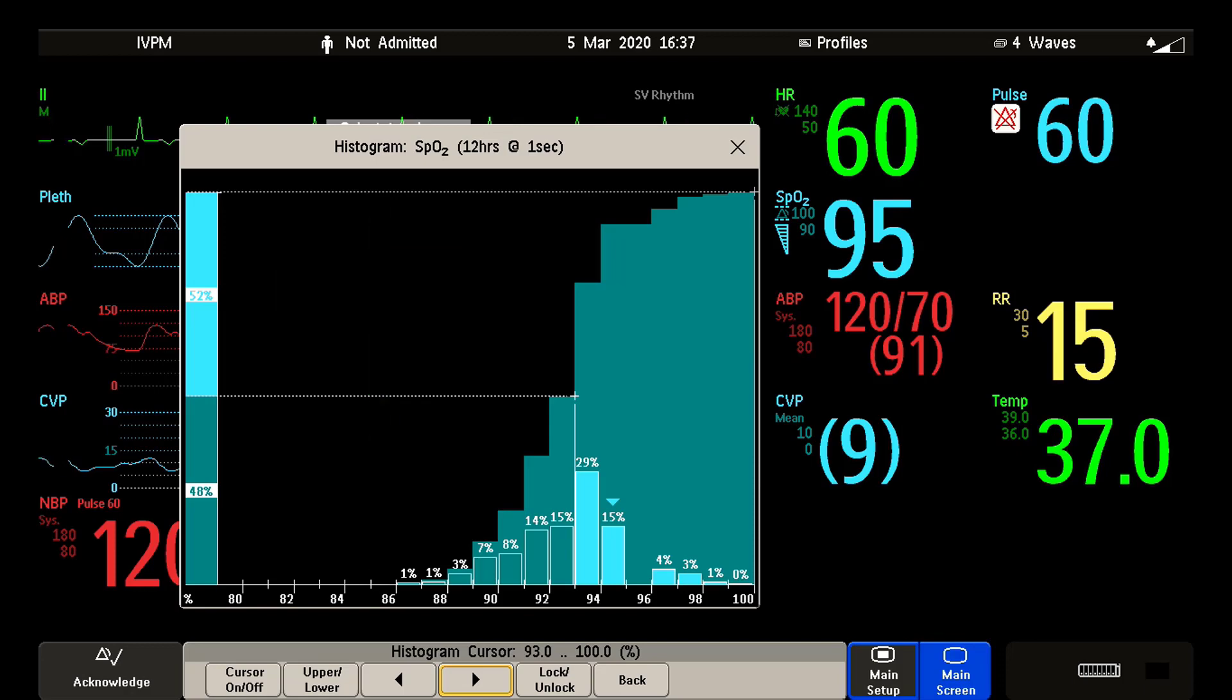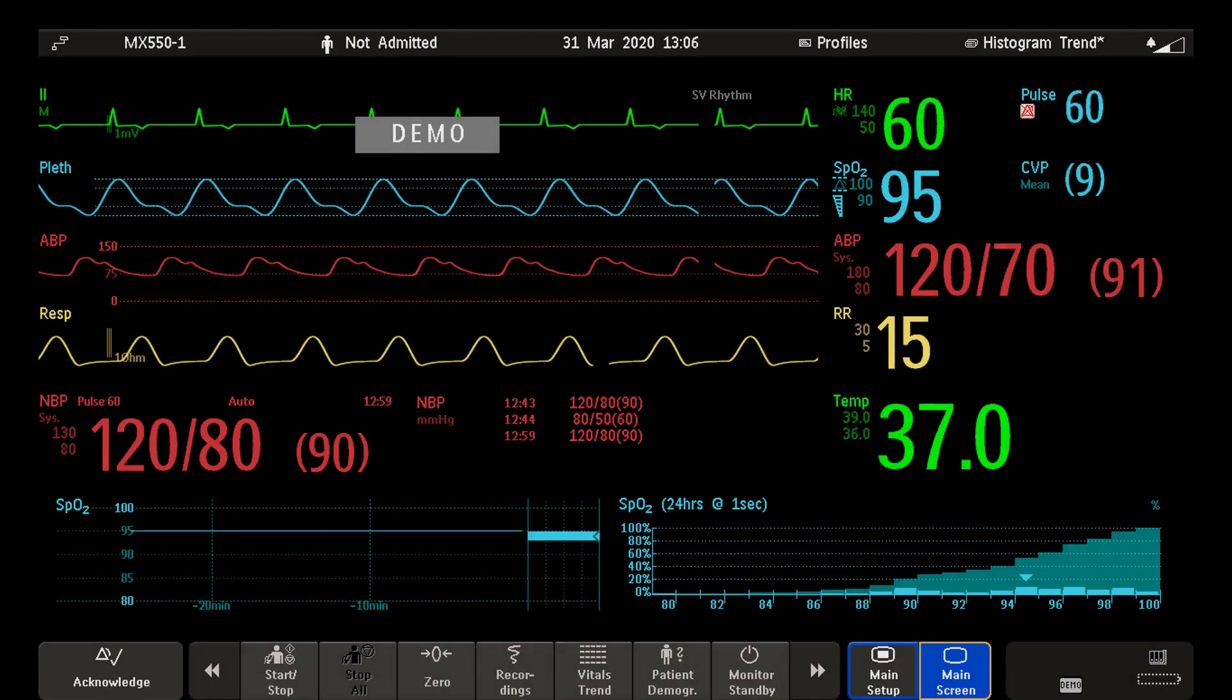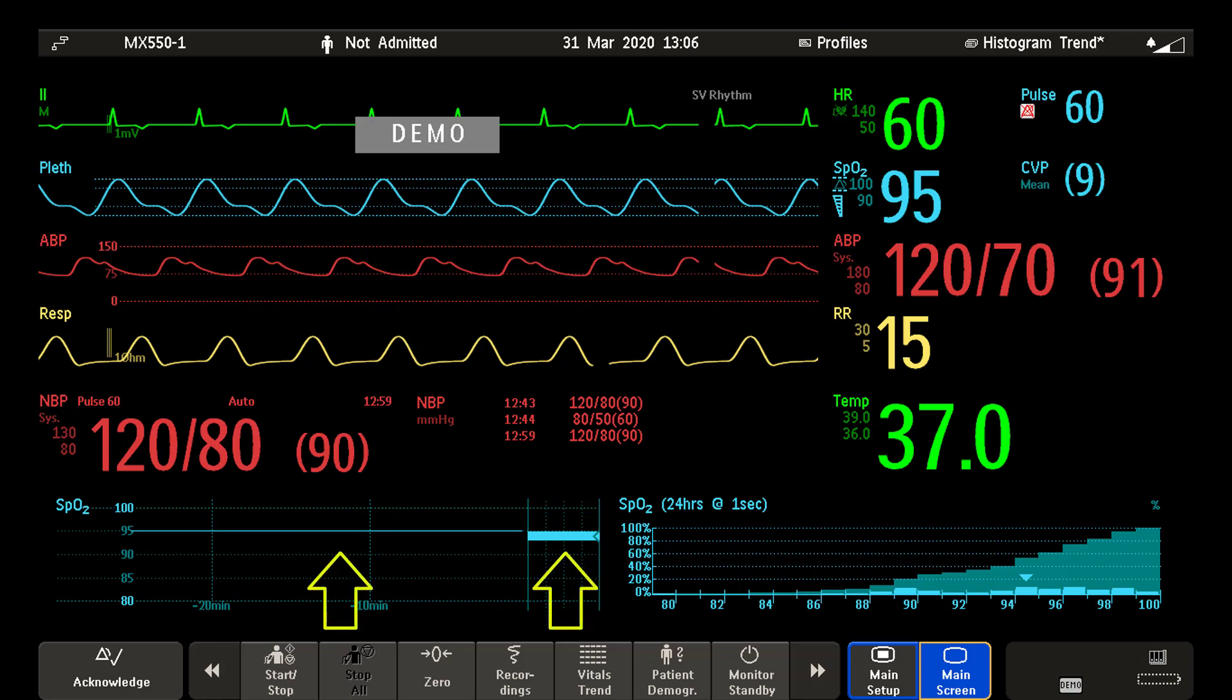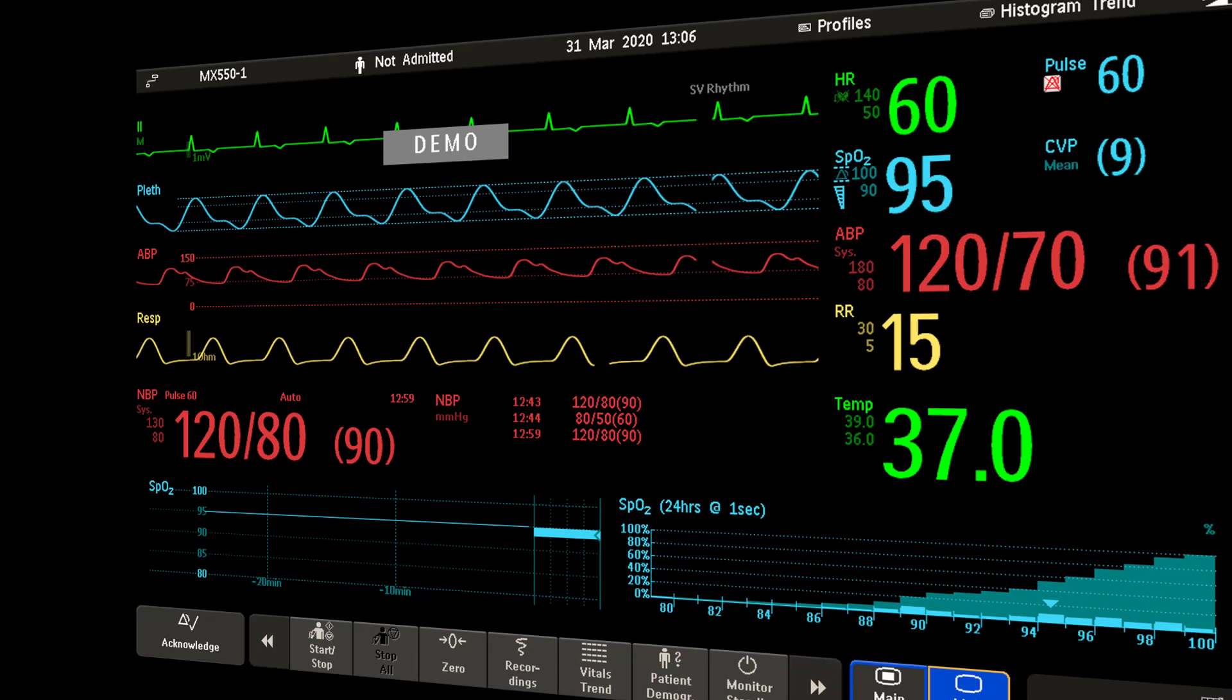It is possible that you have screens in your monitor that display combinations of trends. For example, histogram view is a combination of a graphical trend and histogram.